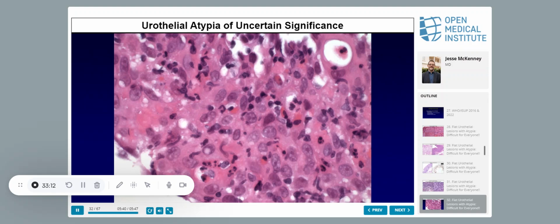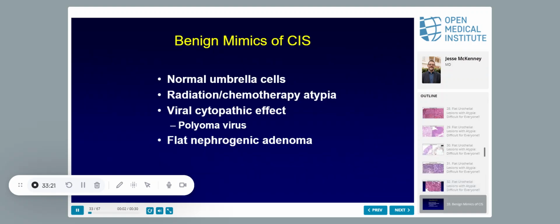Yes? Absolutely. The question was, does CIS colonize von Brunn's nests? You can have a normal surface, and the von Brunn's nest can have CIS. One of the first pictures I showed was actually CIS in a von Brunn's nest. And it's important that you not call those invasive. It's still CIS. All right, we're doing great.